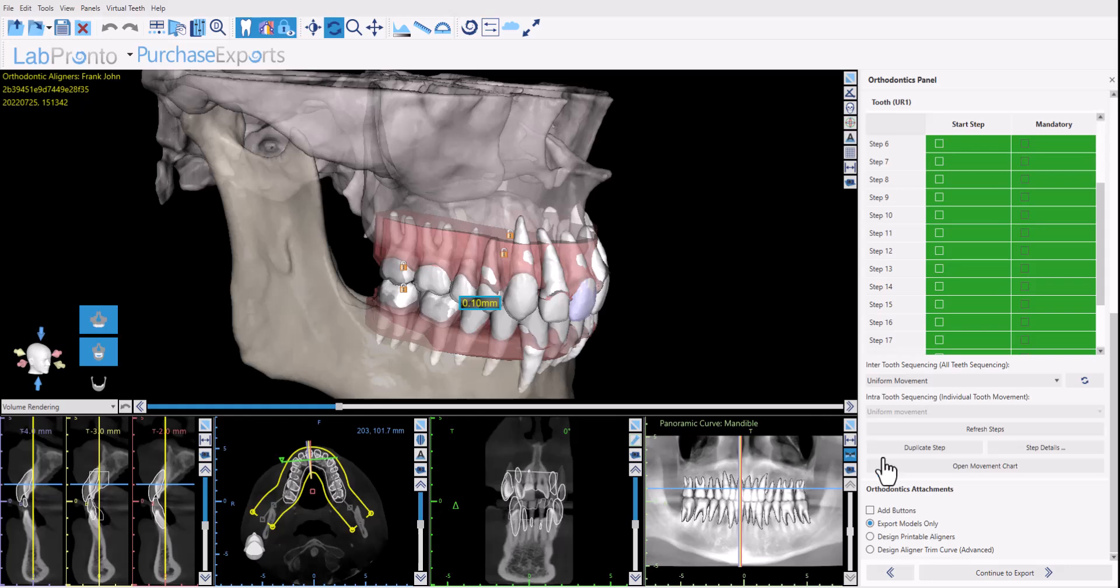BlueSkyPlan has the ability to export the models in addition to designed aligners that have been designed in the software. BlueSkyPlan has FDA approval for direct aligner export. BlueSkyPlan also has the ability to design the aligner trim curve and export the trim curve to the milling machine in addition to the models if you're going to be using the milling machine for automatic model trimming.